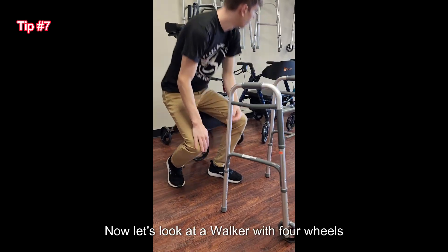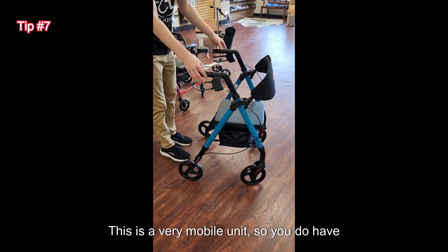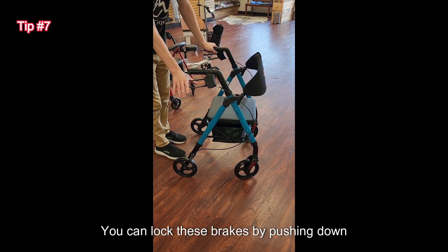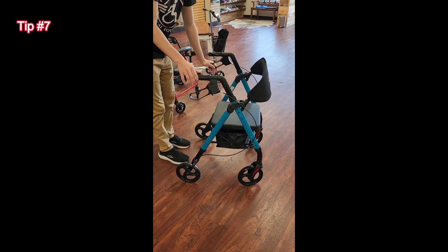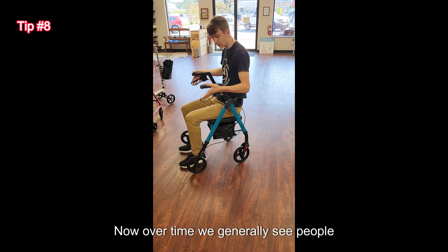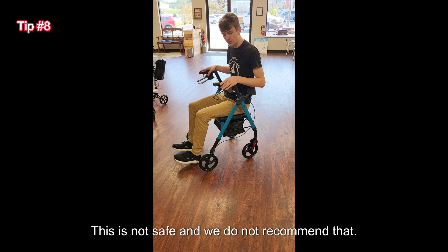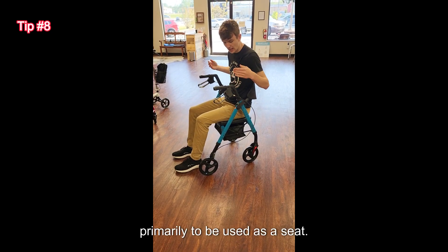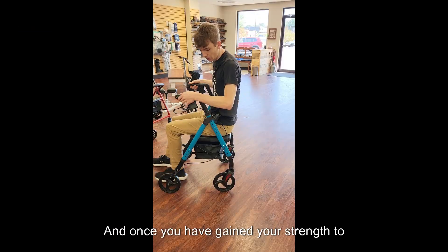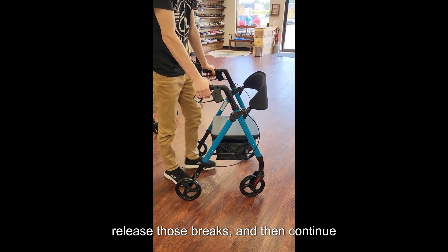Now let's look at a walker with four wheels and a seat, better known as a rollator. This is a very mobile unit so you do have to be careful. It does come with brakes — you can lock these brakes by pushing down on them, which will allow you to safely turn around and sit down. Over time we generally see people undoing these and wanting to roll backwards; this is not safe and we do not recommend that. This is just primarily to be used as a seat. Once you've gained your strength to get back up, you can stand up, release those brakes, and then continue moving.